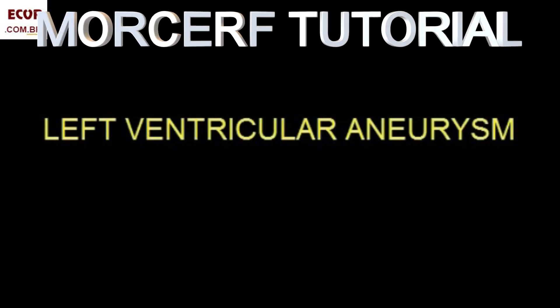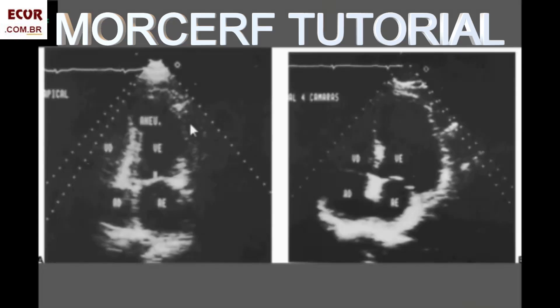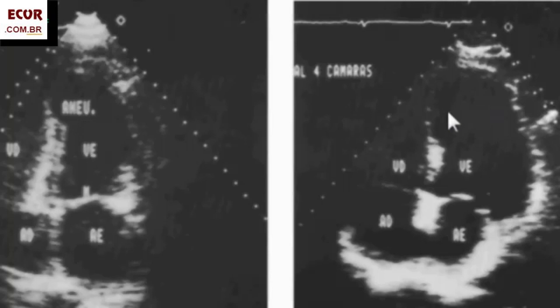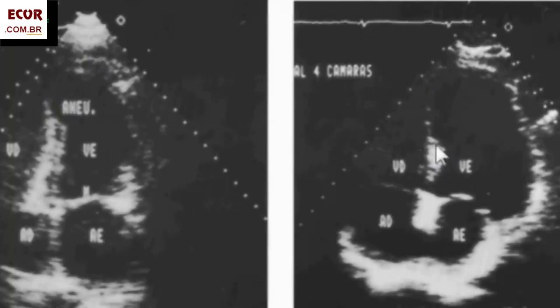Now let's see aneurysm of the left ventricle as the complication of myocardial infarction. For the diagnosis of left ventricular aneurysm, we have to pay attention to three signs. The first is local dilation — in this case, of the apical left ventricle. Then the wall has to be very thin and fibrotic. You can see here that an area that is large suddenly becomes thinner.